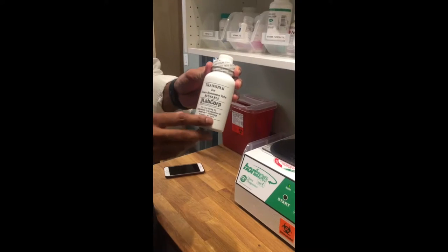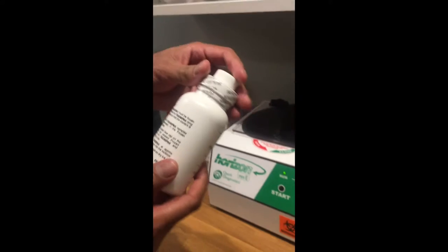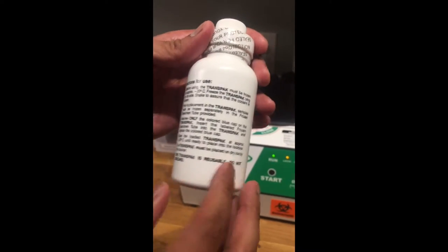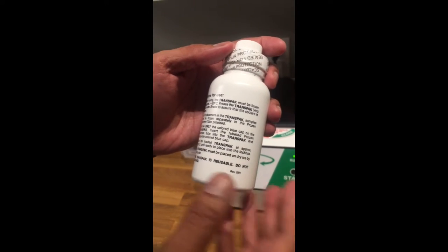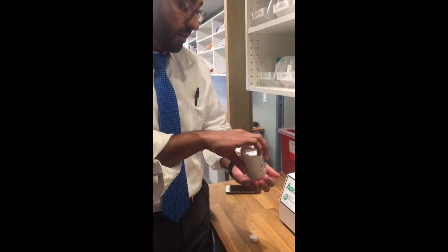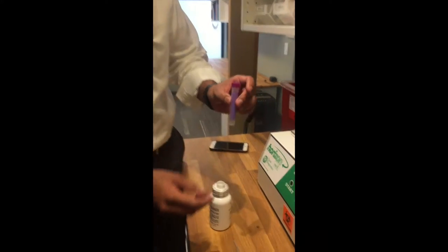Here is LabCorp's transpac that they want used for transportation of the viral load. If you look on the back, it explains how to take care of the transpac. You freeze the transpac lying on its side, shake to assure the coolant is frozen, and the samples must be frozen separately in the frozen specimen tube. When you unscrew this, you have this little tube that comes out — this is where the plasma is going to go.